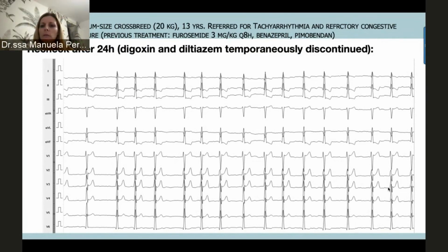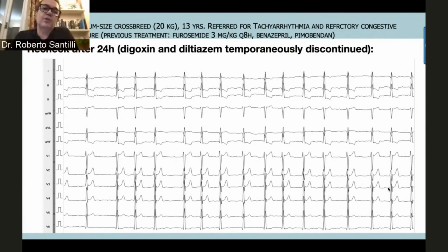Okay, and about this case, Dr. Fiedler is asking if in his case you suggest to use vagolytics and repeat Holter, or just to repeat Holter within 3-6 months. All right, if the dog is not symptomatic, obviously we don't know for this dog what happened when he has prolonged pauses.